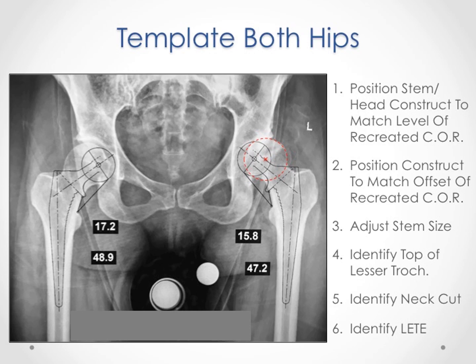Now there's a lot going on here because this is how we put it all together. Once the proper head, neck, and stem size option is selected and positioned on the virtual image, the top of the lesser trochanter is then identified. The distance between the top of the lesser trochanter and the medial aspect of our virtual construct is then measured.